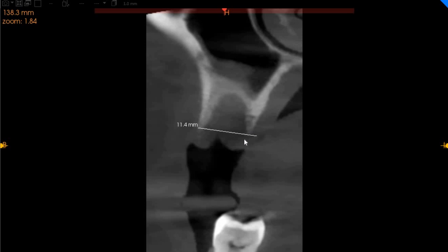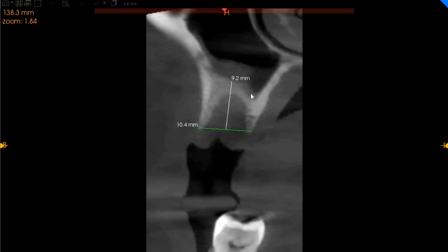Moving to the region of the upper left five, we've got a completely edentulous space extraction socket, as you can see — 10 millimeters of width with 9 millimeters of height, but the actual bone height is just 1.7 millimeters. This place will need to be grafted.